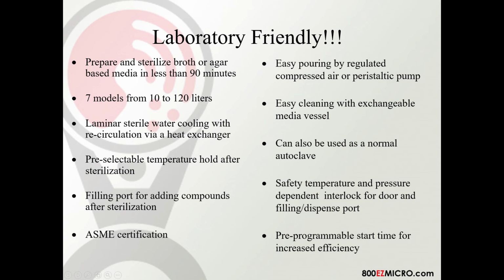So very easy cleaning with the bucket being removed. The system can be used as a normal autoclave, though it's not a normal application for it on a regular basis. We have safety temperature and pressure dependent locks and a pre-programmable start time.